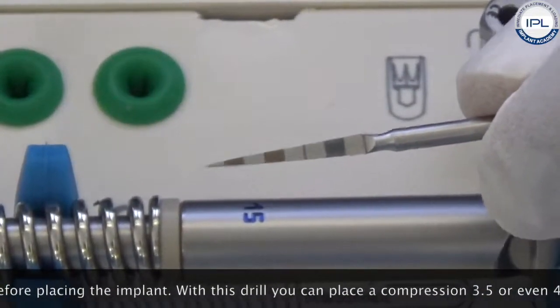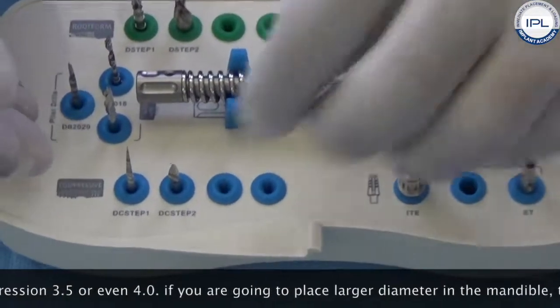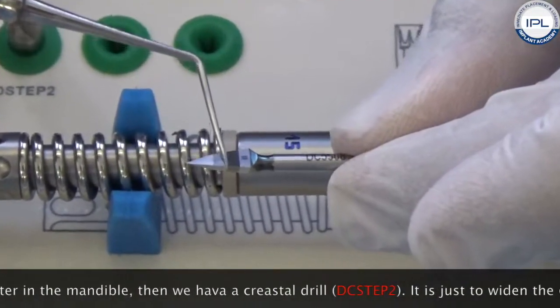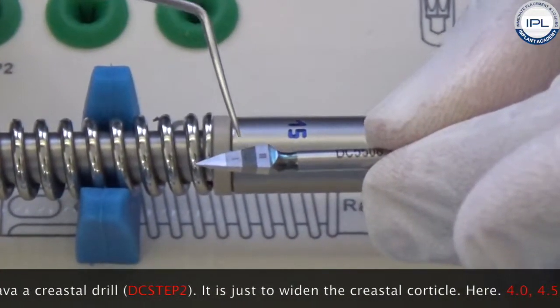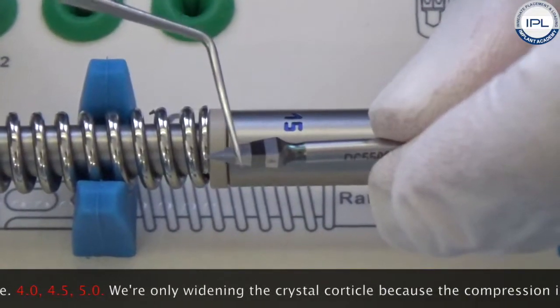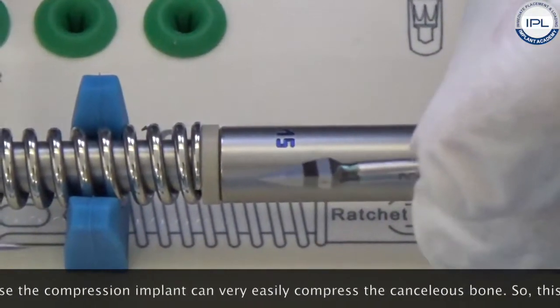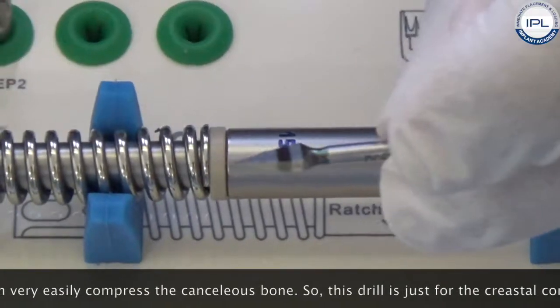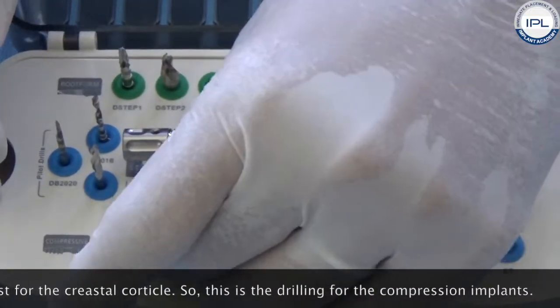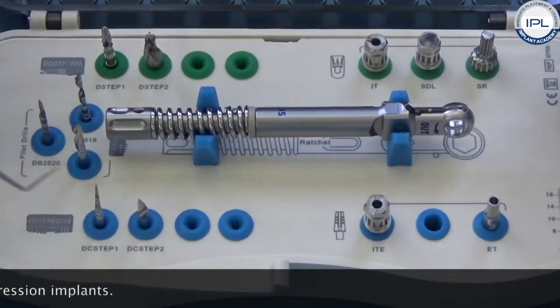If you are going to place larger diameters in the mandible, we have a crestal drill also called DC step 2. This crestal drill is just to widen the crestal cortical bone — up to here for 4.0, up to here for 4.5, up to here for 5.0. We are only widening the crestal cortical because the compression implant can very easily compress cancellous bone. So this drill is just for the crestal cortical. In the maxilla minimal drilling is required; in the mandible you may need to follow the entire protocol.